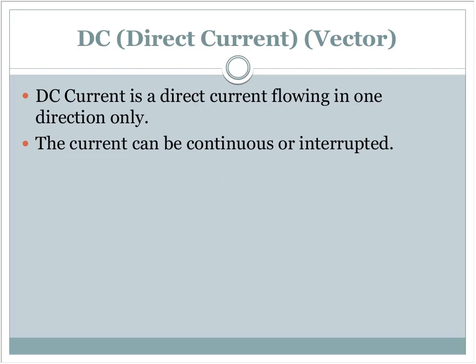It's very irritating because it's obviously direct current, which means you're pumping in all positive or all negative. And because those electrodes don't change at all, you're attracting negative or positive ions to the area, depending upon which electrode it is. I know when I said with the high volt, that's actually beneficial for a wound.